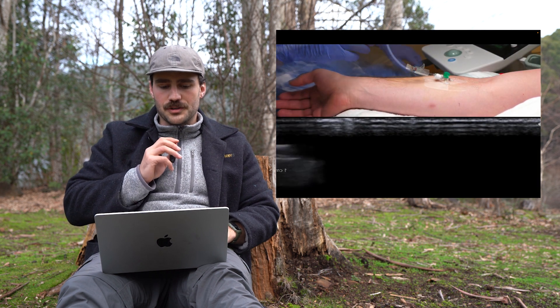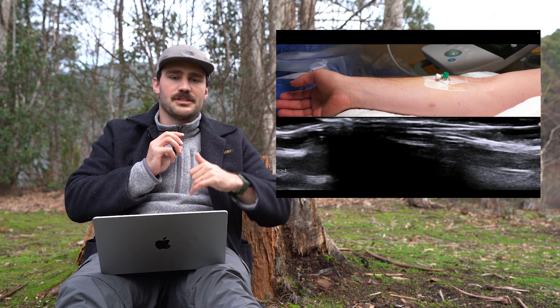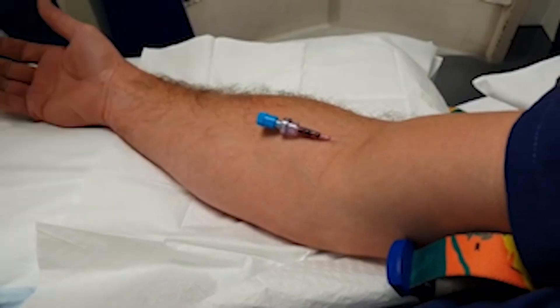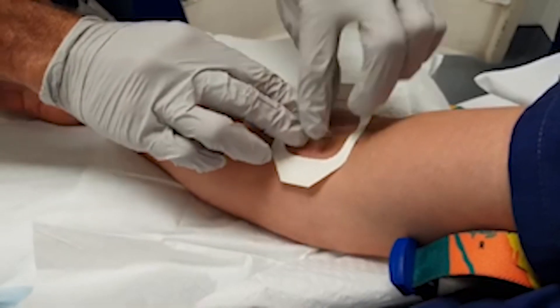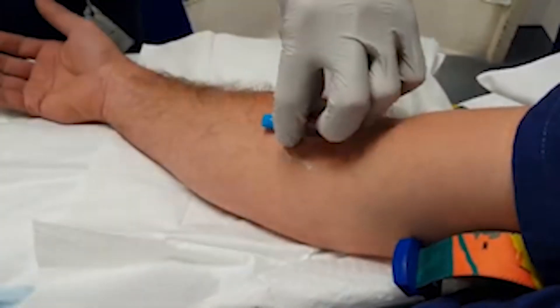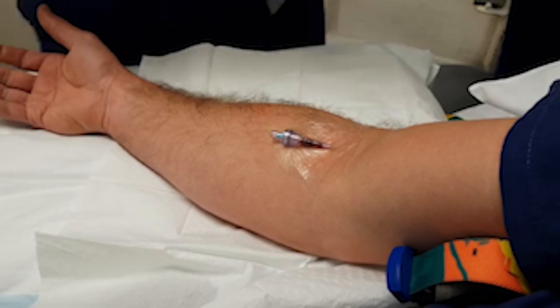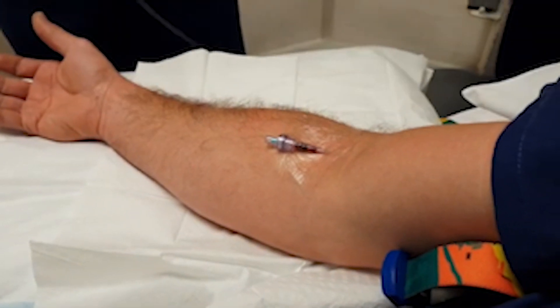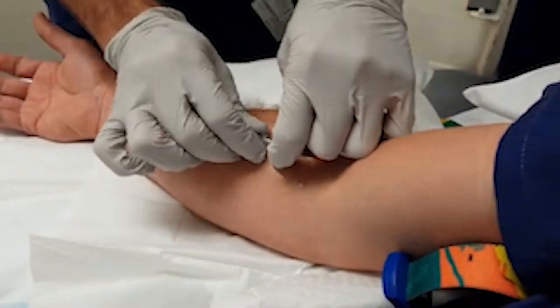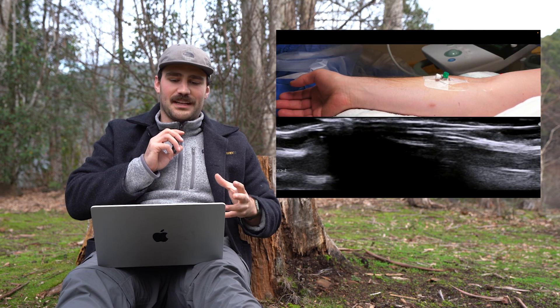At this point the ultrasound goes away. They've applied all this dressing and removed the needle — the needle goes in the sharps bin. What happens next is we get a dressing called a Tegaderm, or some other equivalent depending on the organization. The clear plastic see-through part goes around the site of entry, and that's really important so we can look for signs of infection or any other issues — which would mean we need to change the cannula. If we covered it with something we can't see through, that's not ideal.